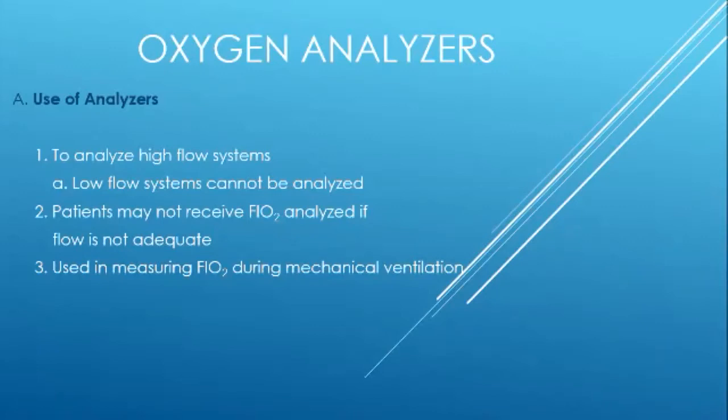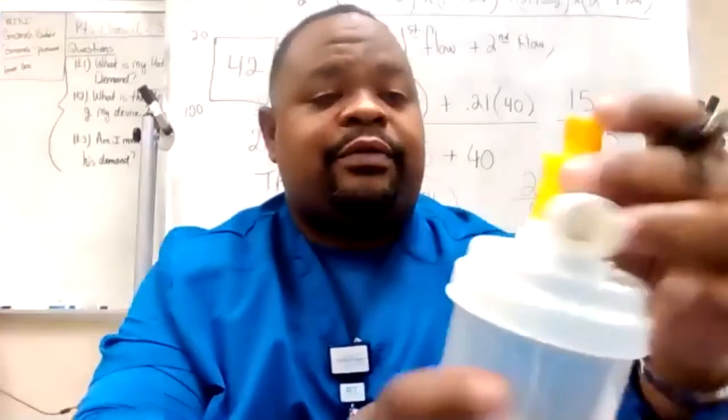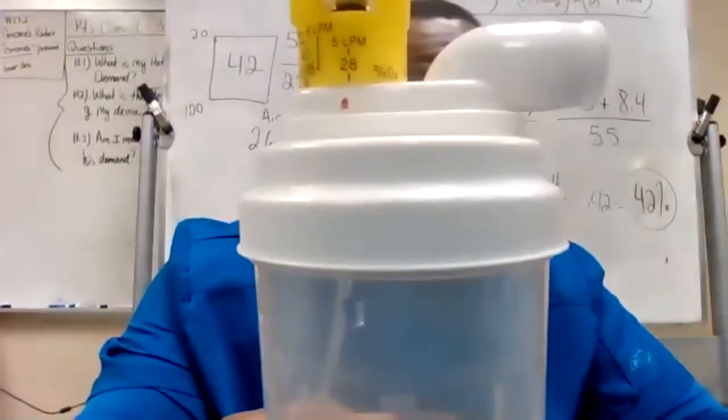All right, last thing, oxygen analyzers. Oxygen analyzers, guys, are simply devices that we can put into the flow of the gas and tell me how much oxygen it is. It may say on this Venturi system that they're actually getting what? This right here says what? How many percent?